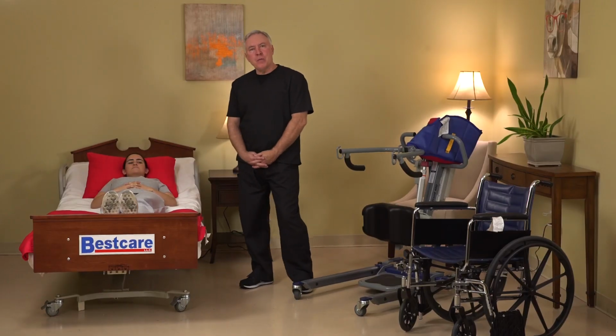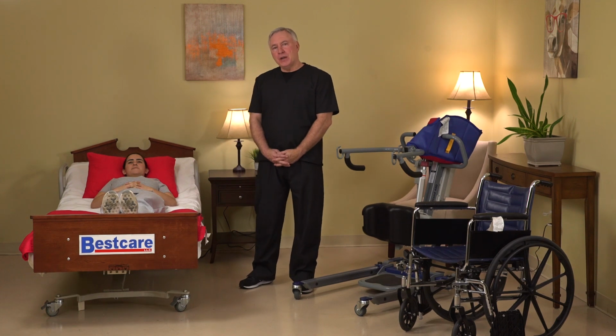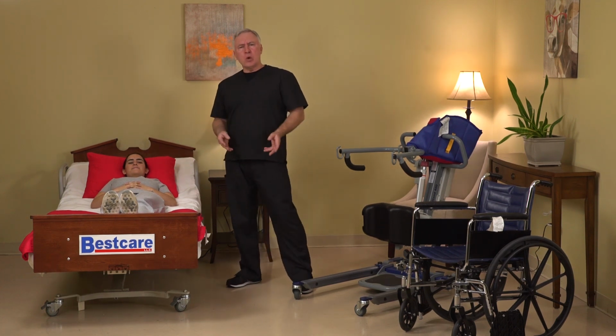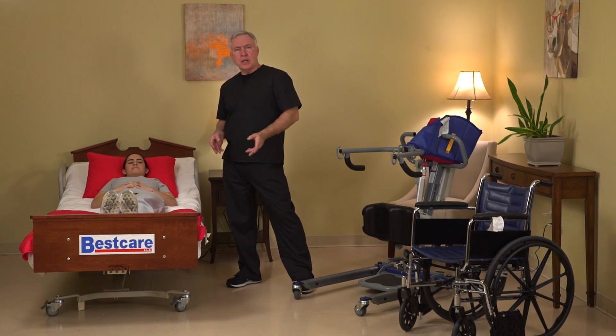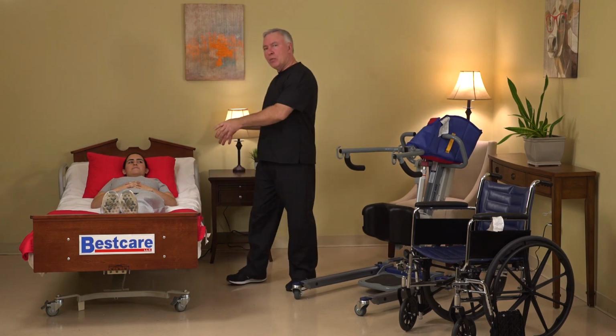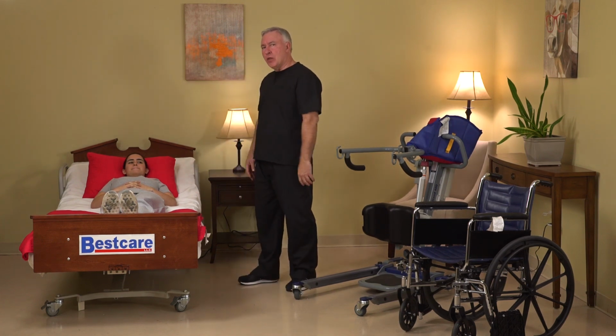Okay folks, now it's time for me to show you how to use the BestStand to transfer the patient from the bed to the wheelchair. We get a lot of questions about this transfer because the product, as we know, is a transfer from a sit to a stand position, so the patient has to be seated. So we have to help this patient into the seated position on the bed.